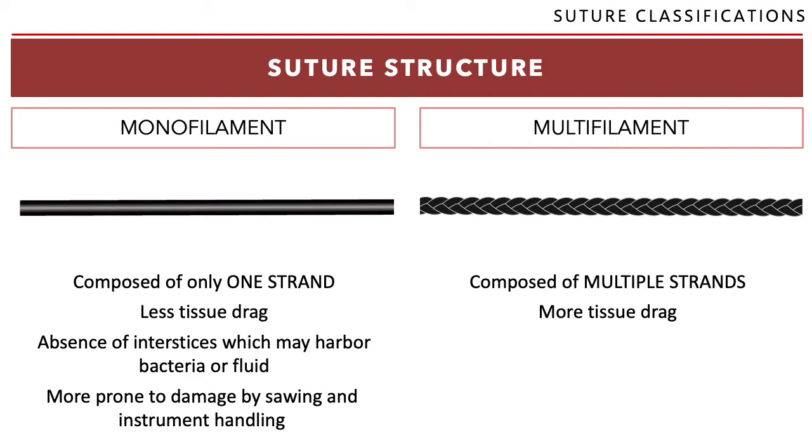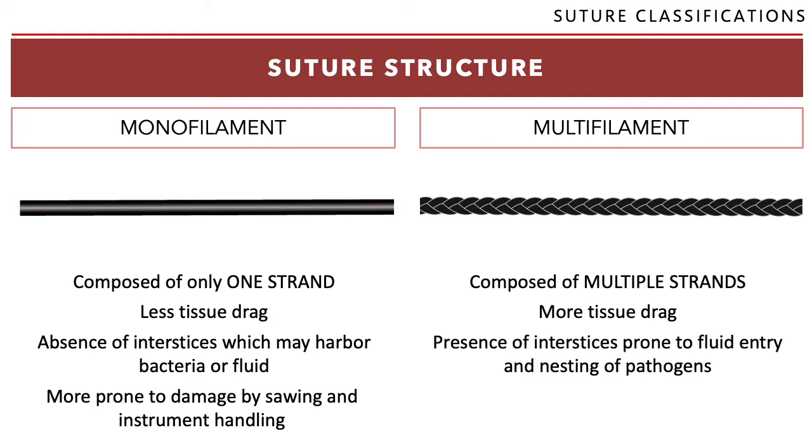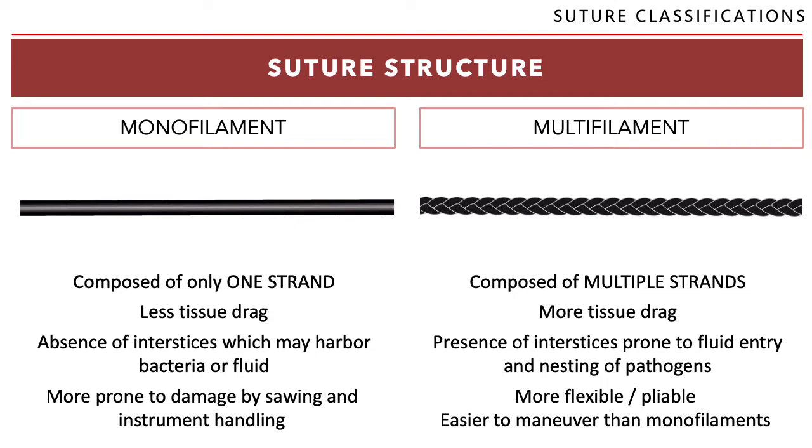Okay? That's a multifilament. Now, if you look at your hair, girls, if you have long hair, or guys, if you have long hair, you could see it should be monofilament. Kapag multifilament yan, may split ends yan. Alright? And that actually renders it weaker. So this is actually more flexible, more pliable, and easier to maneuver than the monofilaments. That's how I envision it.